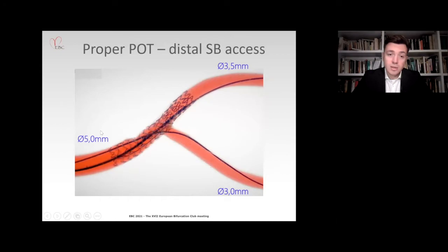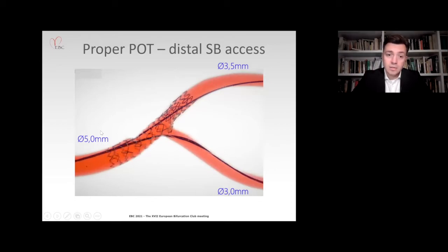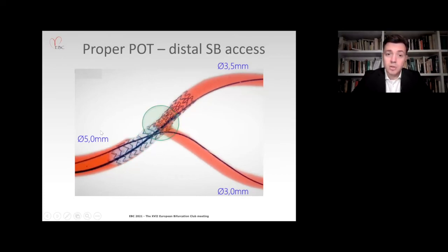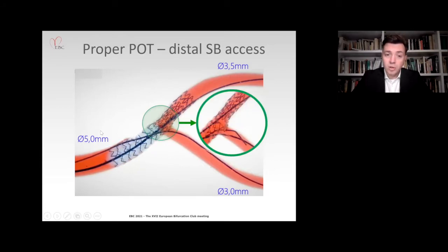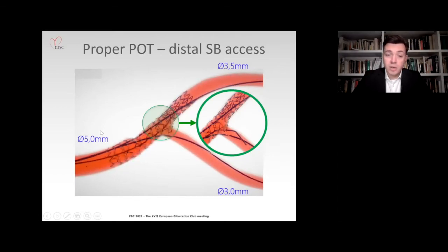As you can see on this Bench test, proper POT may require two balloon inflations. We need to take care of the proximal edge of the stent, and we need to be precise at the carina. After performing optimal POT, the wire still preferably goes through the proximal cell; however, we have given ourselves the chance of rewiring through the distal part, as you can see now. Performing POT requires meticulous proceeding and may require more than one inflation. We need to be precise at the proximal edge, but also at the distal edge of the bifurcation core. Only then can we allow ourselves the opportunity to have distal side branch access.